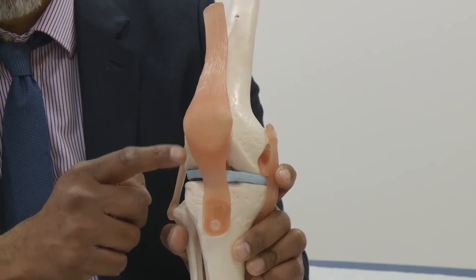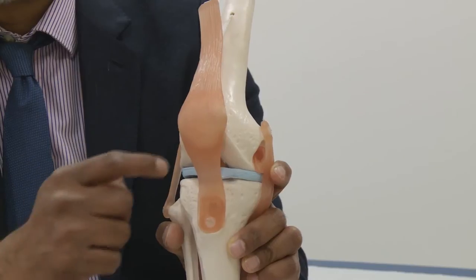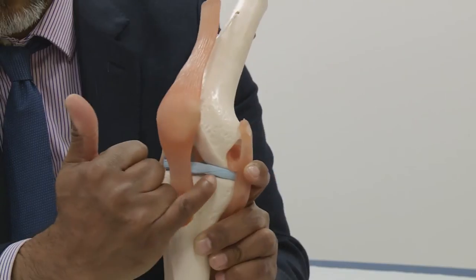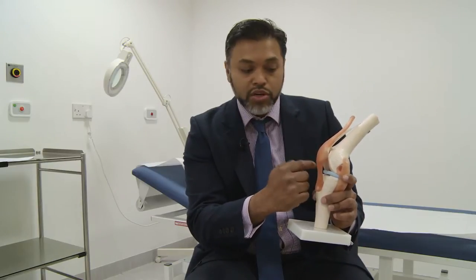The surgery is done under a general anaesthetic. The anaesthetist will see you on the morning of the operation and explain the details to you. The surgical procedure involves making an incision on the outer aspect of your knee, where we use an arthroscope — a camera — to look inside the knee and assess and record the damage. Following that, we make another incision on the inner aspect of the knee, which is a similar size.